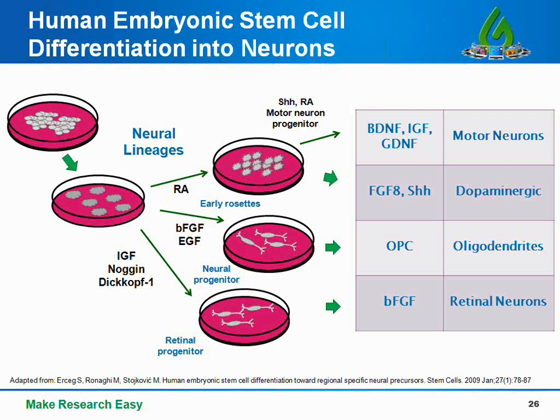The neural precursors are then transferred to Matrigel and treated with epidermal growth factor and platelet-derived growth factor, differentiating these progenitors into early oligodendritic precursor cells, which was verified by specific cell marker expression. Now, at this point, the growth factors are removed, and the cells are treated with thyroid hormone, which forms mature oligodendrocytes.